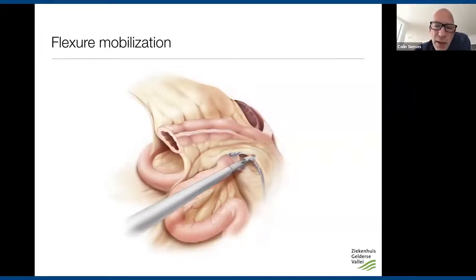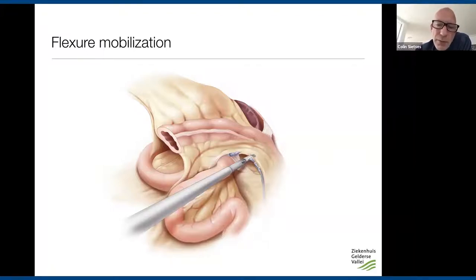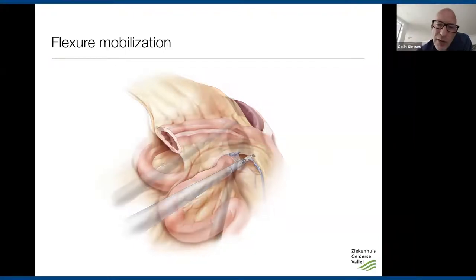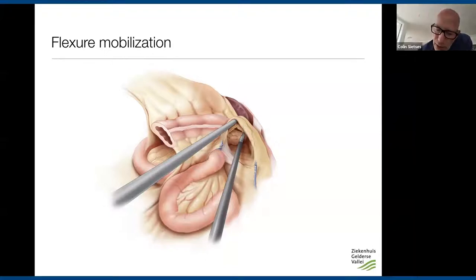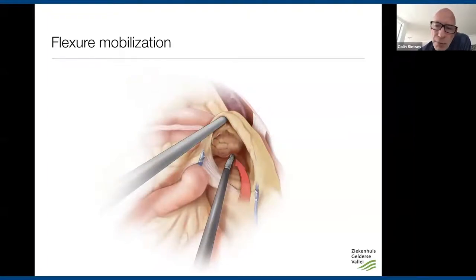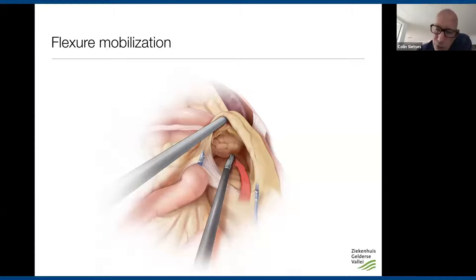Cut the inferior mesenteric vein at the border of the pancreas to ensure enough length for re-anastomosis and to complete the lymphadenectomy — remove all tissue to the pancreatic border. For the first entry into the lesser sac, rather than following Gerota's fascia (which risks going beneath the pancreas and causing bleeding), I prefer making a window in the mesentery of the transverse colon. This approach is safer for less experienced surgeons.